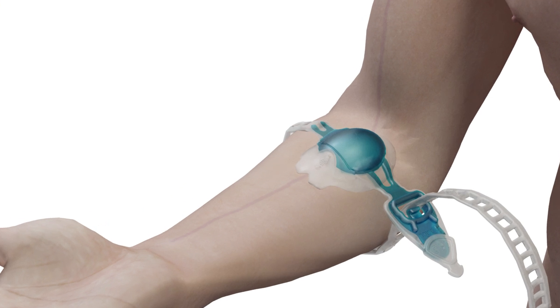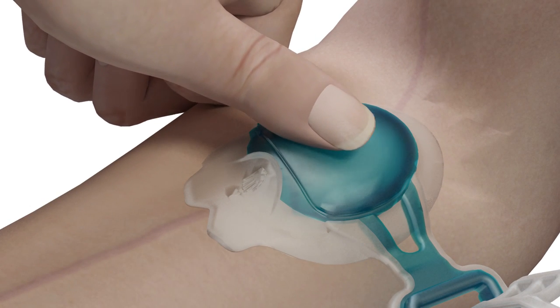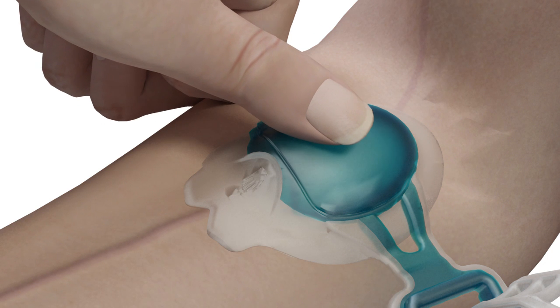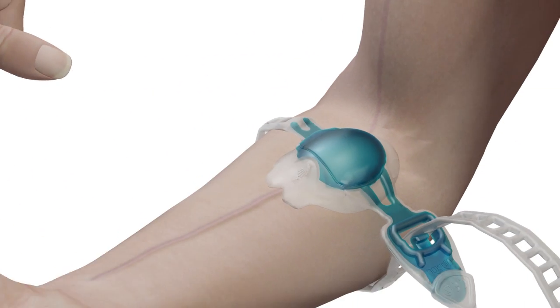Pump the vacuoderm repeatedly by pressing the dome with the free hand. This will generate pulses of vacuum. Now the section of vein under and in front of the vacuoderm is further distended and ready for cannulation.